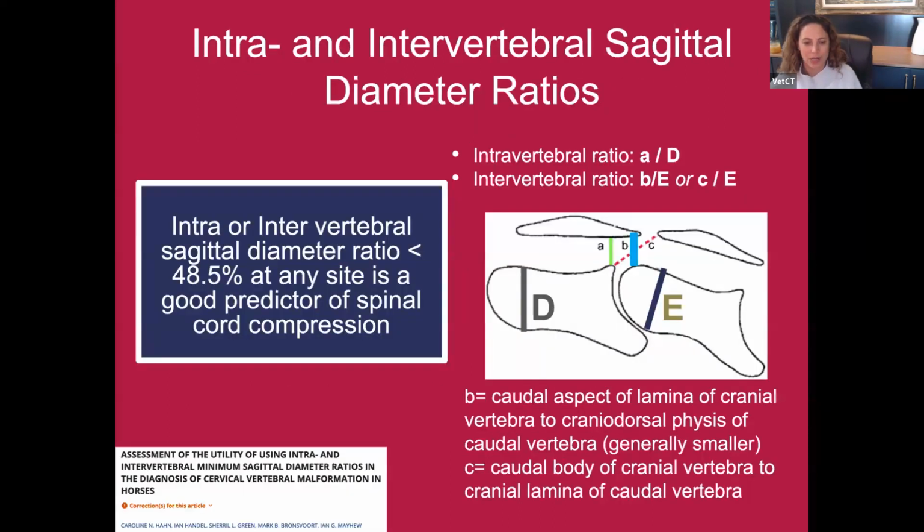Okay, there's a really nice paper by Hahn and others. It's a few years old now, but it describes these measurements really nicely. If this is something you're doing a fair amount or you want to be doing more of in your practice, I highly recommend reading this paper. But basically, you measure two different ratios.